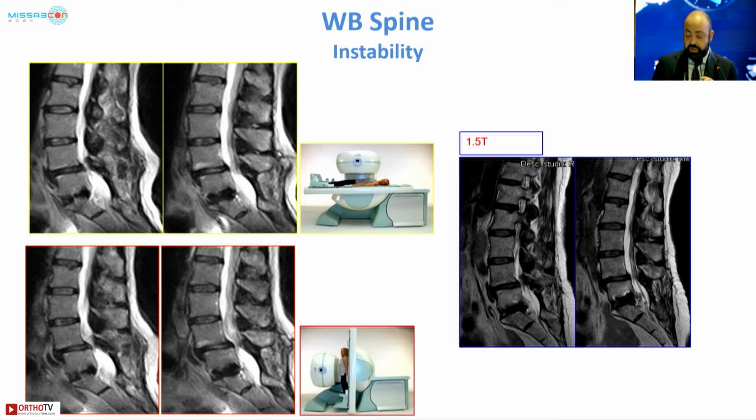Before and after surgery, weight-bearing examination can give lots of information. This is an example of a postoperative examination with conventional MRI that was not able to directly show the presence of residual instability that is well demonstrated in the examination in the upright position.